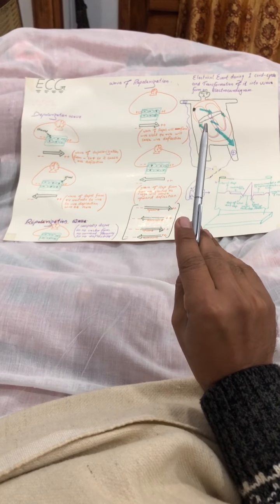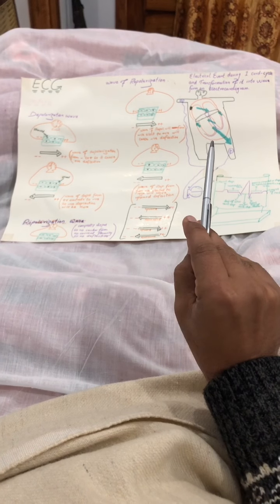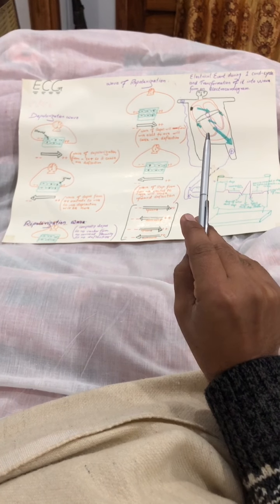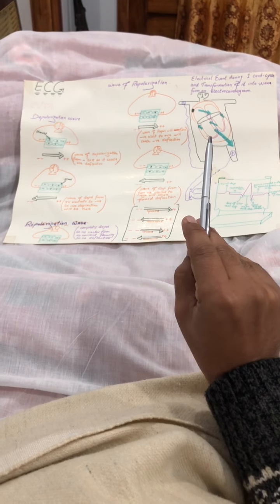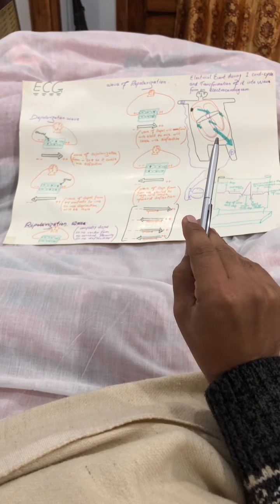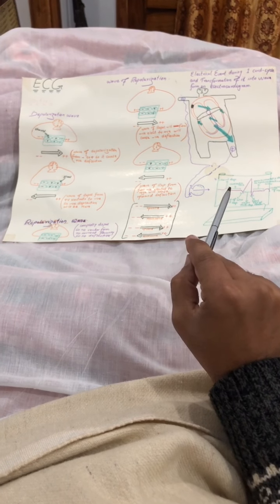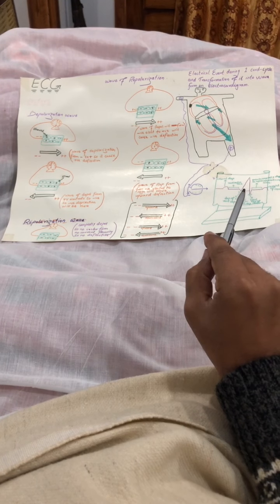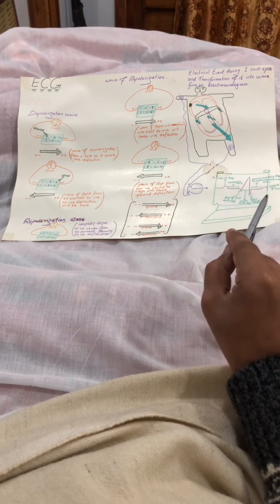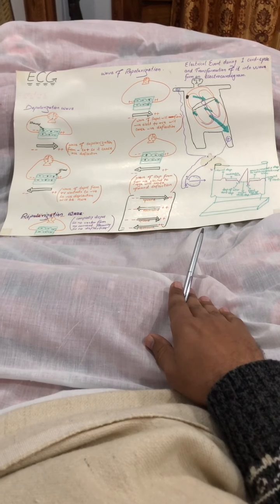See, this is the normal heart, very ugly human being, but it's okay. Sorry for that, my drawing is not so good. Then after that we're gonna apply it on the normal heart, which is going to make the normal physiological waveform of the ECG: P, Q, R, S, and T. Okay, this is the normal physiological waveform of the ECG.